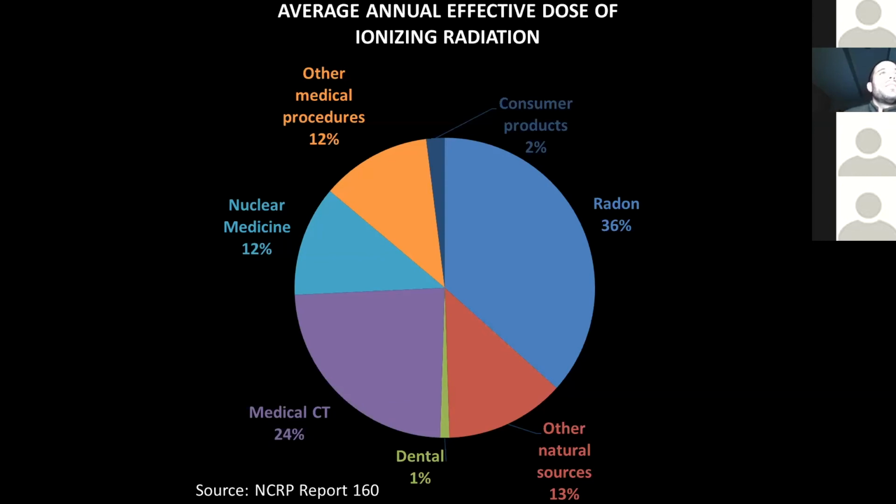Next question is, by decreasing image quality, is there a possibility to miss a medical or dental condition such as lesions? Yes, there is. But that ties into whether we are screening that patient for incidental or surprise pathology, or we are taking a scan for a specific indication. And we'll build on that discussion slightly next week.